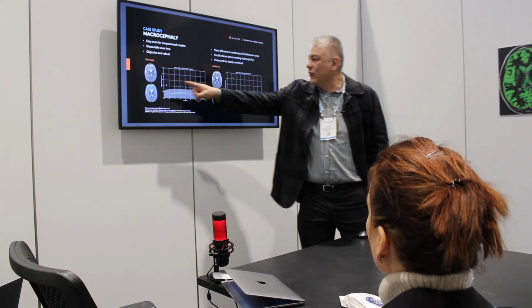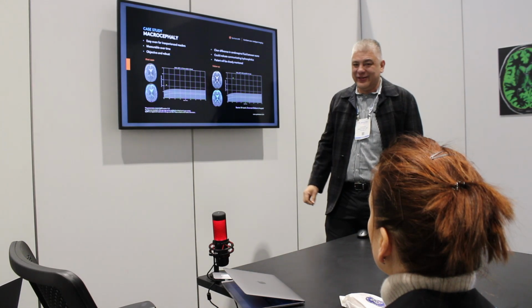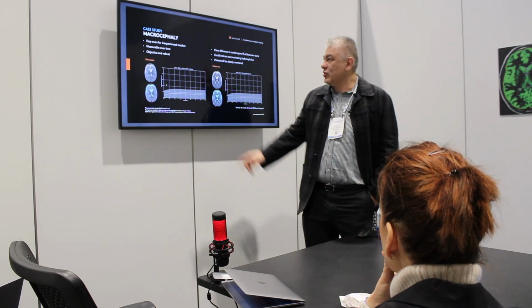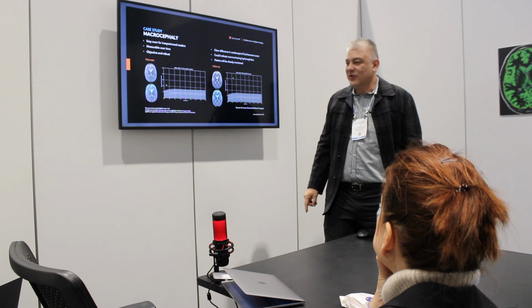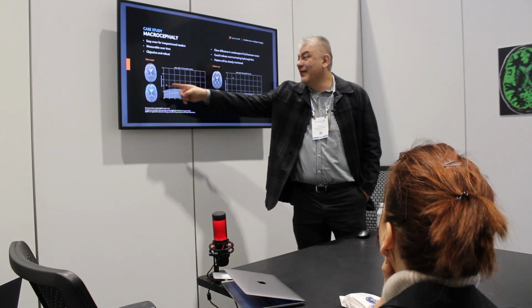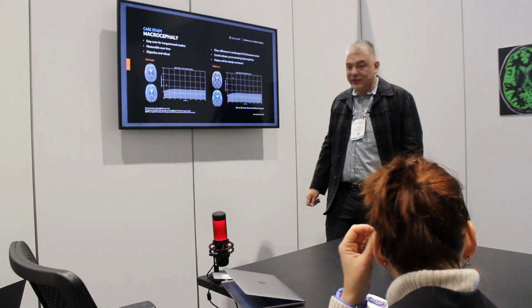Yeah. And if you compare this with that, can you really tell? Just by looking at images, it's so much worse. So this is now the volumetry? Yeah, this is the CSF volume. This is objectively measuring CSF volumes. So now we're seeing that when we actually measure the volumes, you can see. Okay, this is now the CSF. Yeah, it's a CSF volume.